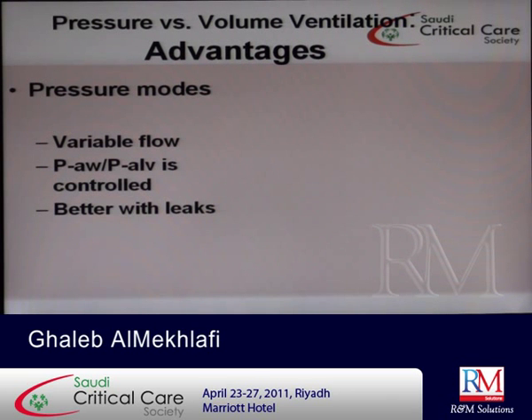So cycling is the event that when it is reached, the ventilator closes the inspiratory valve and opens the expiratory valve. Clear? So cycling is the transition or the parameter that determines the point at which the ventilator will change into expiration. If I use a pressure cycling ventilator and I set a pressure of, say, 20, once that pressure is reached, the ventilator will go to expiration.